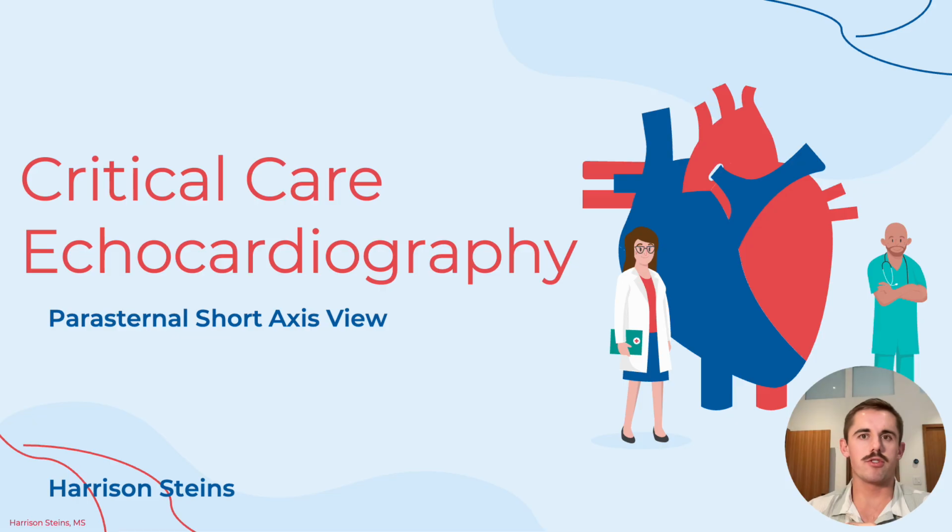To obtain this image, generally take in cardiac mode your probe from facing the right shoulder and rotate it 90 degrees to face the left shoulder. And this will get your probe from the parasternal long axis view to the parasternal short axis view.